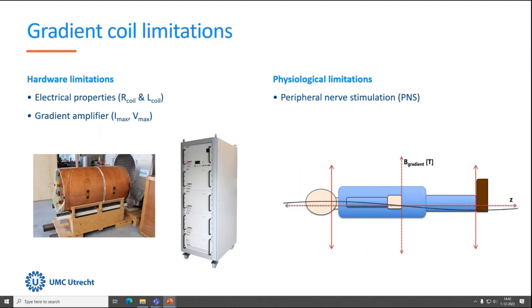Well, when you switch gradients, you'll see large swings in the magnetic field, right? And of course, in the middle, the swings are not so large. Basically, what we're interested in for the encoding is the slope. But at your feet, you'll see large absolute swings in the magnetic field, also at the head. And these will polarize the nerves and cause peripheral nerve stimulation.